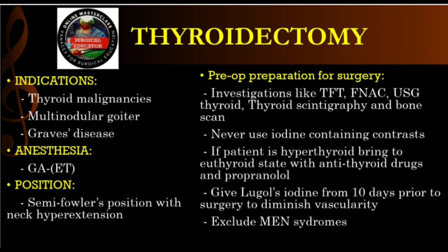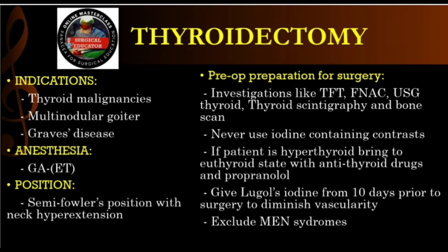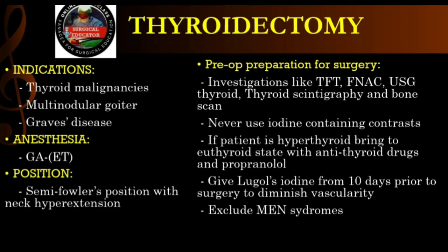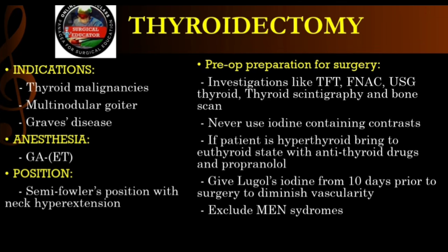Or the vocal cord spasming, because later on we're dissecting right next to the recurrent laryngeal nerves. Which control the vocal cords. Right. And if you irritate those nerves, the cords can spasm shut. If they just have a mask on, they stop moving air entirely. But with a cuffed tube physically sitting between the cords, the airway is stented open. Exactly. It's the ultimate safety net for the anesthesiologist and the surgeon. Okay, so the airway is secure.